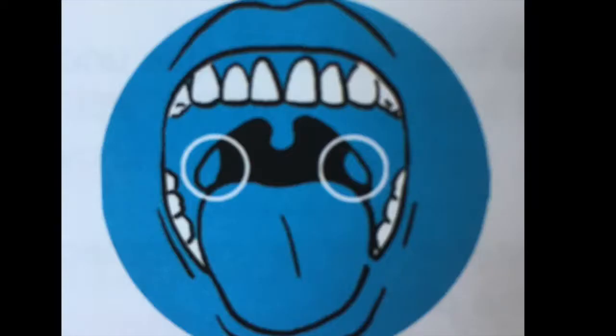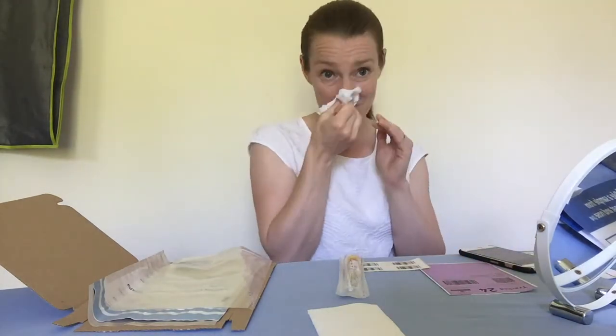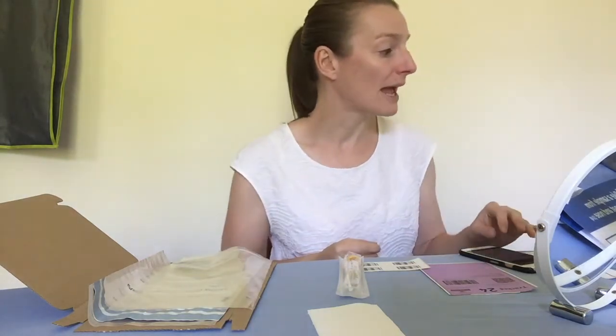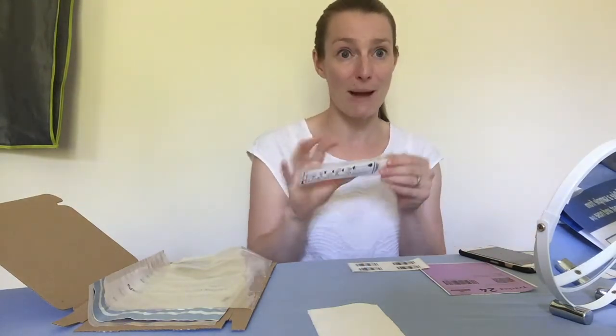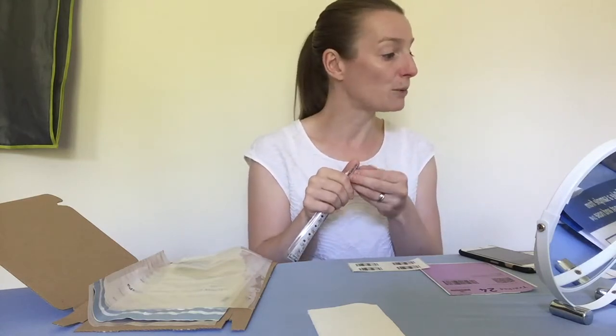The tonsils are at the back of your throat on either side. Once you've done that, it asks you to blow your nose, making sure you put the tissue in the bin. Then you need to take your swab package — which is this one here — and very carefully open it up.